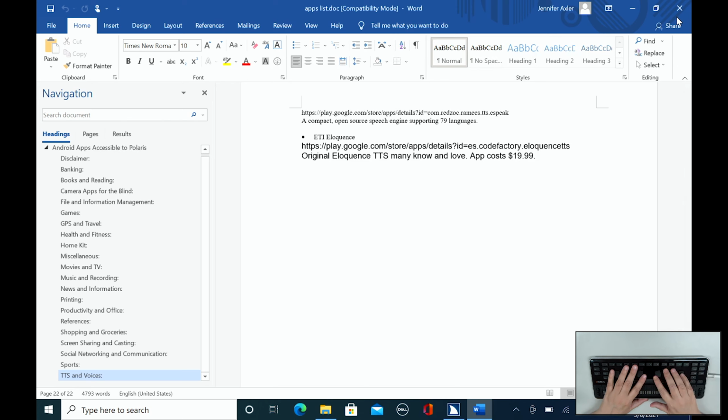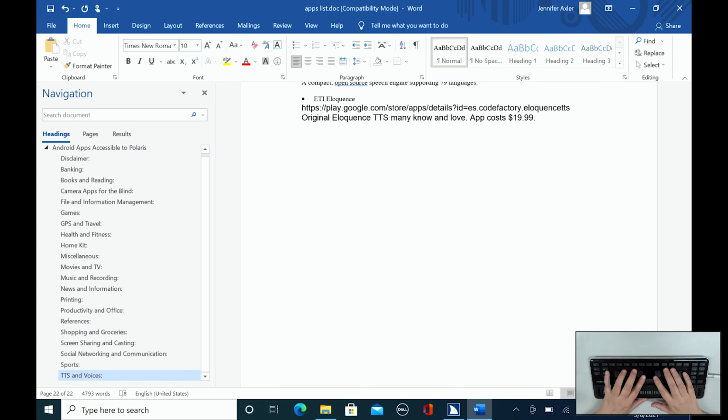And again, this is the advantage of this keyboard, that it's intuitive no matter how you look at it. Whether you are using Braille keystrokes or a combination, or if you want to know that strange Control-Alt-1 keystroke, you don't have to think about it. It is Control-Alt-1. So let's actually go through a few examples of how that plays out. So the first thing I want to do is turn quick keys off, so I'll press Caps Lock Z again. Quick keys off. And now I'm going to press Enter a couple times.